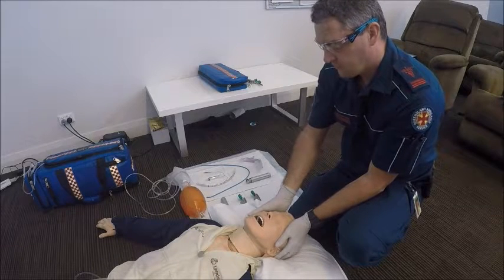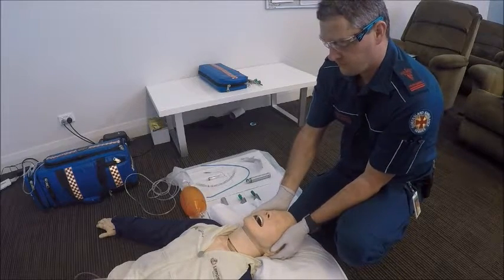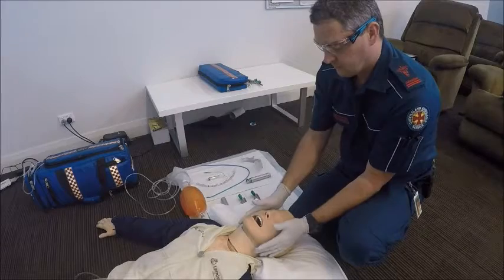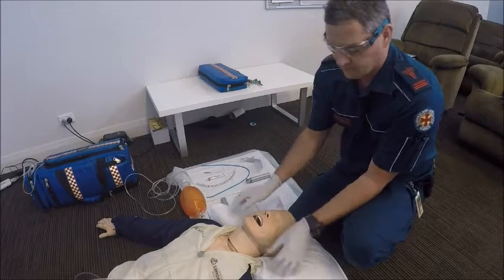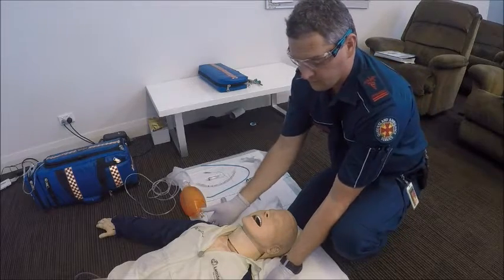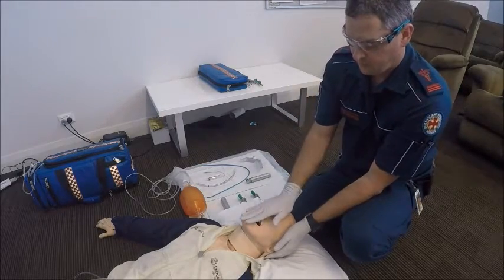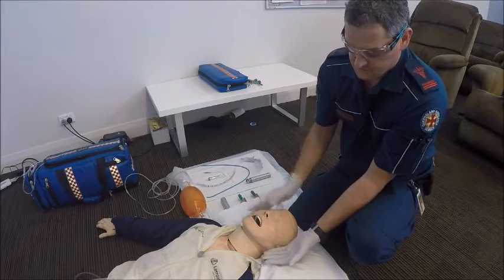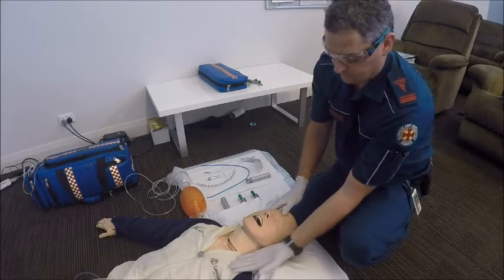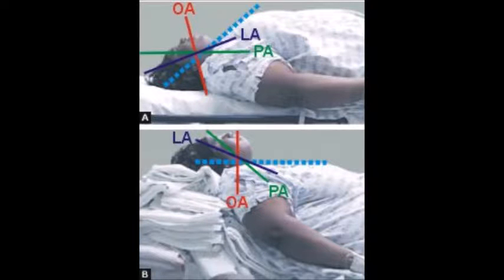In the event that we have an obese patient, a patient with large breasts, or a pregnant patient for example, sometimes to facilitate the best view of the glottic opening we have to use what's called the ramp position, which we do by padding up underneath the shoulders and underneath the occiput, keeping the face parallel to the ceiling. The ultimate objective is to line the ear with the sternal notch with the face parallel to the ceiling. The ramp position with the alignment of the different axes can be seen here in this graphic.